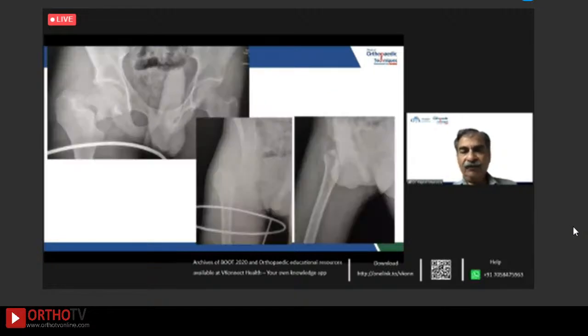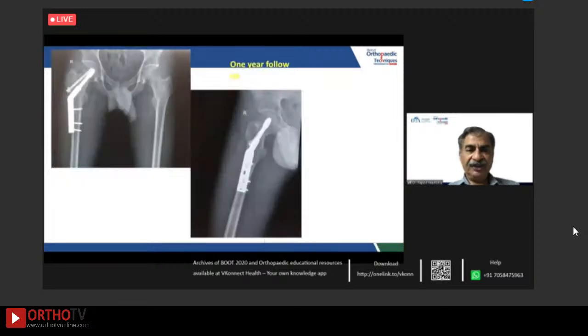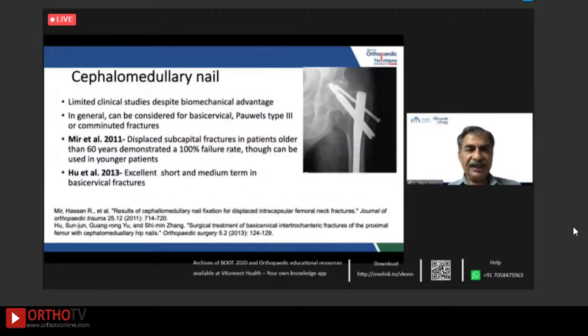This is an example of a fracture neck of femur treated with the sliding hip screw, which of course always has to be done with the derotation screw. A word here, a lot of surgeons are wary of using this combination for undisplaced fracture for the fear of displacing the undisplaced fracture because of the torque. In spite of fixing it, maybe even through to the acetabulum, like Dr. Vikas Agashe showed, still it doesn't provide enough stability. So this is the 1 year follow-up of the same patient.